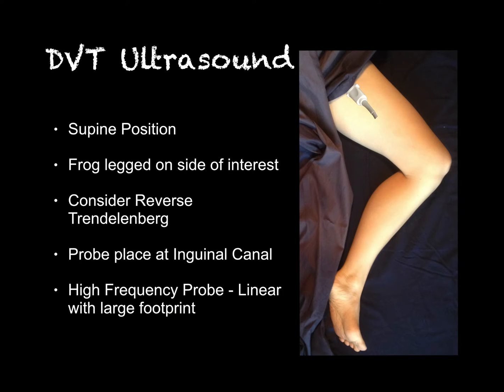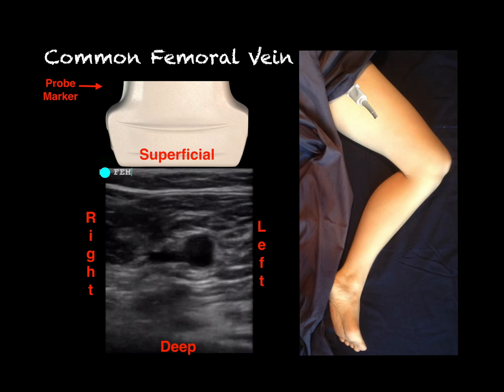When positioning patients, put them in a supine position and lower the head of the bed down so they are completely supine. With obese patients, the abdomen can hang over the inguinal area, making it hard to evaluate that region — so lay them flat and stretch out their back. Additionally, have them bend their knee and externally rotate, putting them in a frog-leg position. You can also use reverse Trendelenburg to make veins more plethoric and easier to see. Use a high-frequency linear probe placed right up near the inguinal ligament.